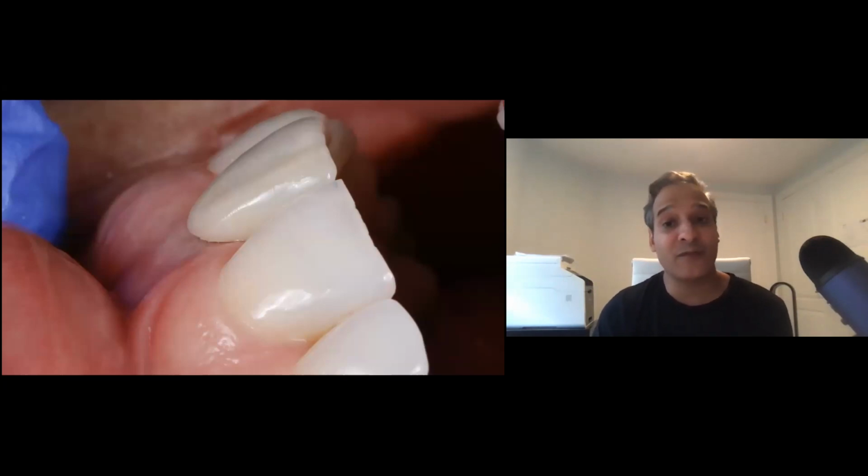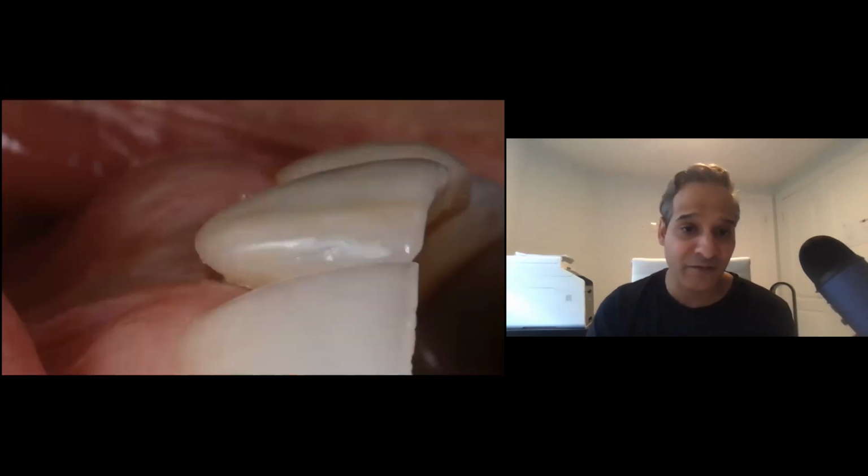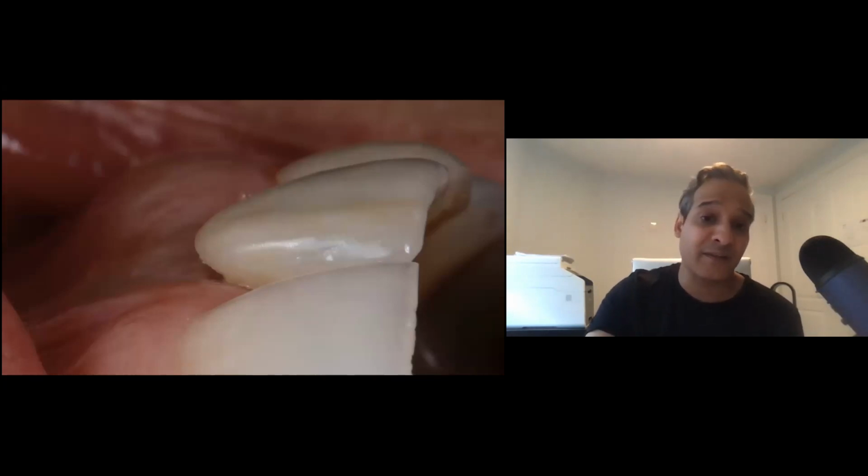And so this is mainly an issue. The implant itself was positioned nicely. It was a screw retained implant. There's nothing wrong with it, but from a surgical point, they should have known that, wait a minute, there's a soft tissue deficiency. If you look closely, you can see there's actually a gap or a space. They had to leave it like this so that there's access for, I'm assuming, hygiene.